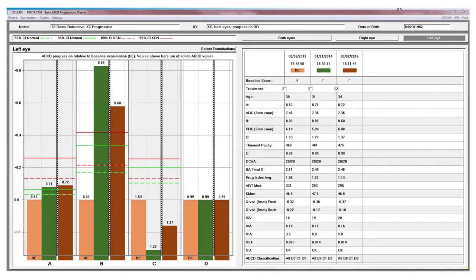A new feature from the Oculus Pentacam is our keratoconus progression display. This is designed to look at several measurements over time including anterior curvature, posterior curvature, corneal thickness and best corrected visual acuity to assess whether or not the patient is progressing.